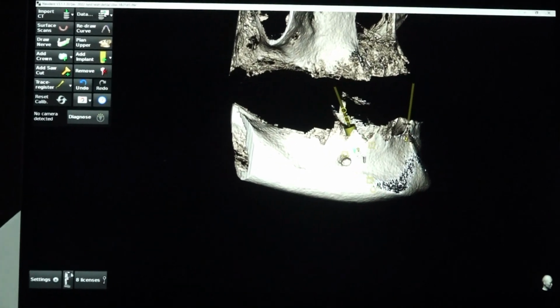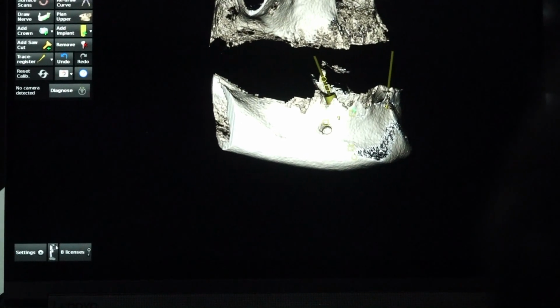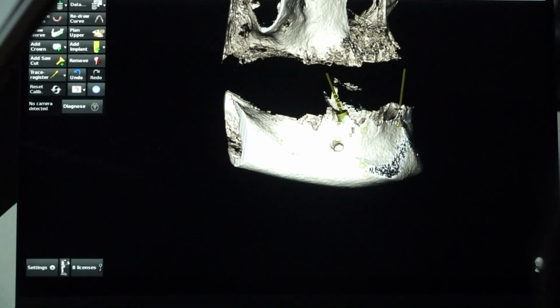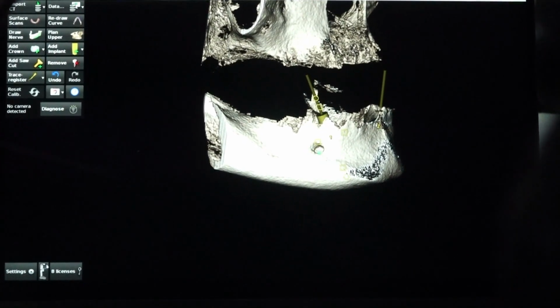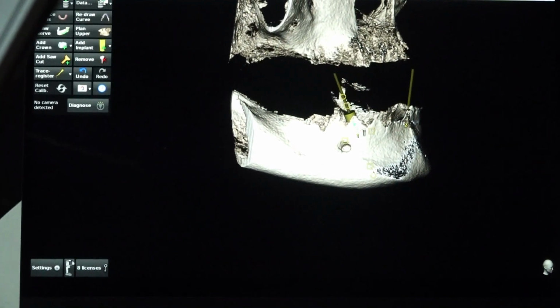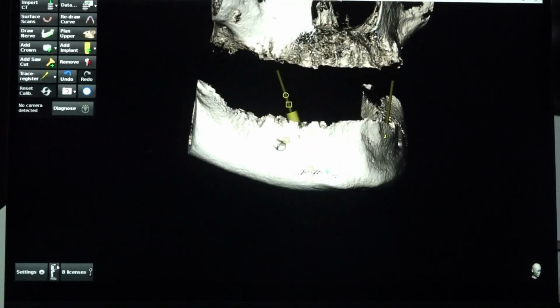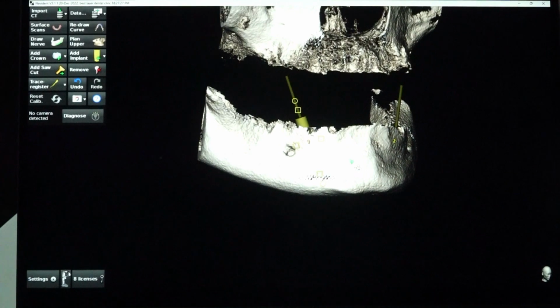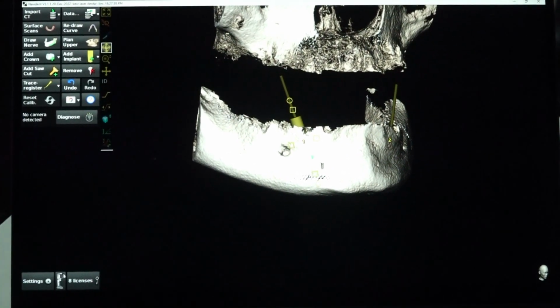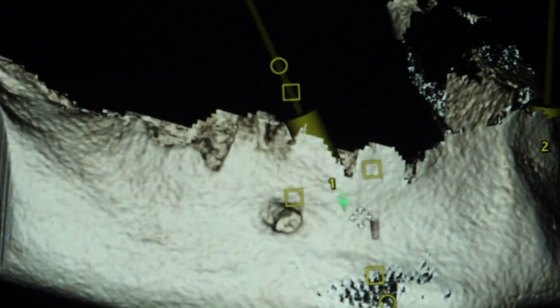So when you are tilting the premolar implant, there are two categories from where your drilling starts, whether it is the first premolar or second premolar, or between the second premolar and first molar. The location of the mental foramen determines that. Then how much tilting you are going to give mesially. If you tilt too much mesially, our anterior implant may come closer to the tilted implant. If the tilting is very less, you may injure the mental anterior loop. So a correct amount of tilting is indicated.